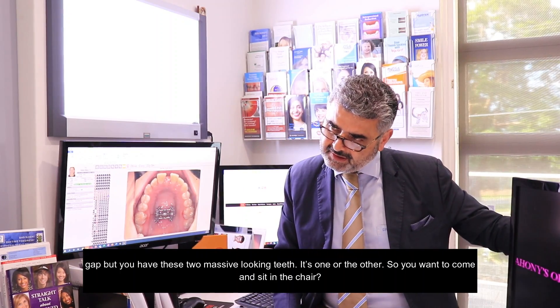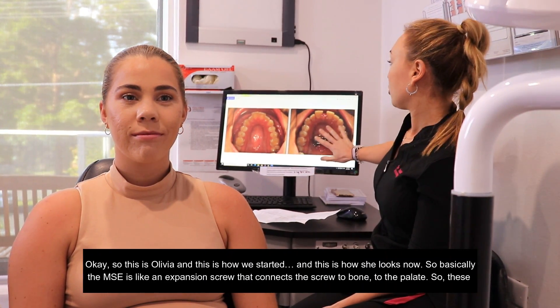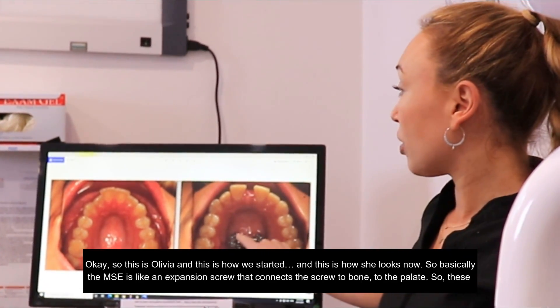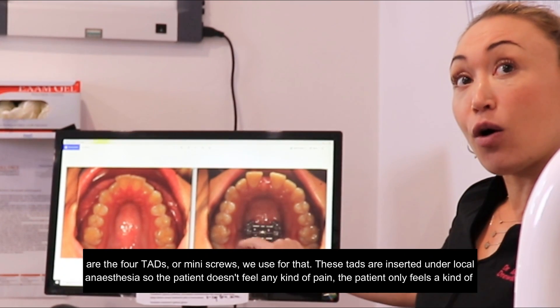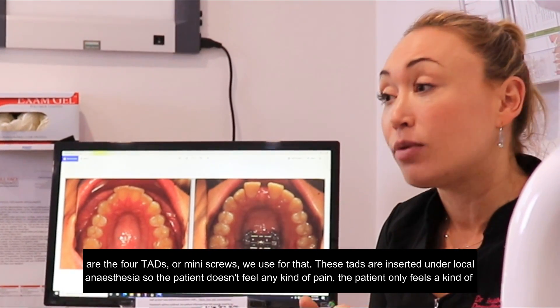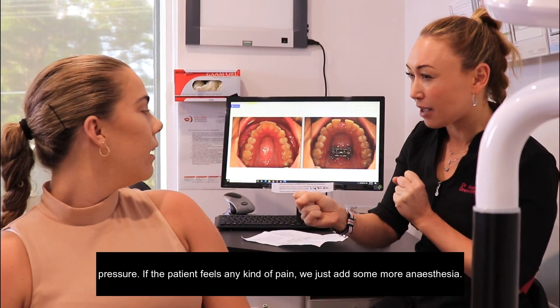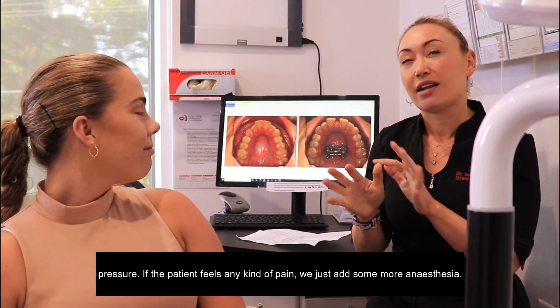So this is Olivia — this is how we started and this is how she looks now. Basically the MSE is like an expansion screw that connects the screw to the bone, to the palate. These are the four TADs or mini-screws we use for that. These TADs are inserted under local anaesthesia so the patient doesn't feel any pain — only pressure. If the patient feels any pain, we just add some more anaesthesia and then it should be fine.